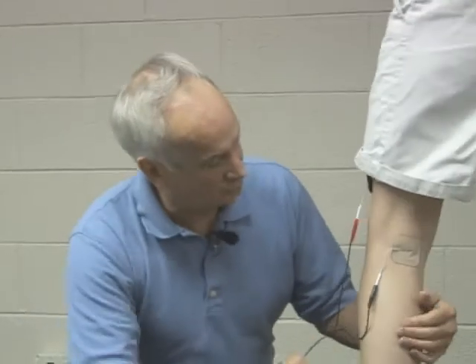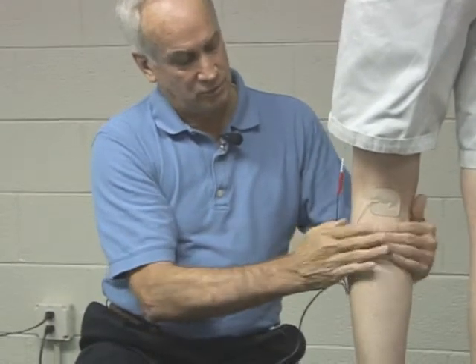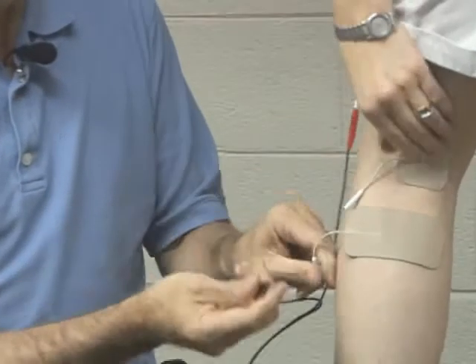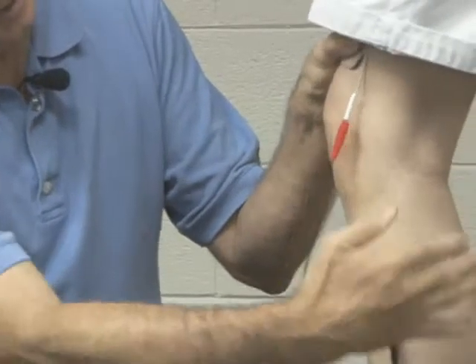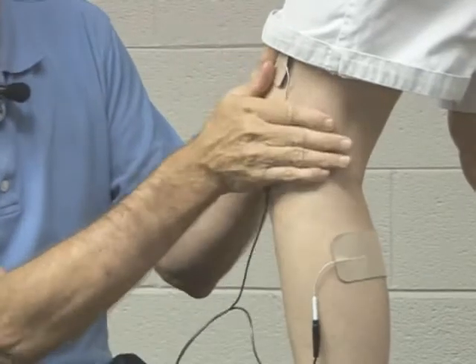For a second placement — if the popliteal area wasn't sensitive — I might put it down here where she has some muscle tissue. I'll pull this out and plug this channel in here. If she turns sideways, electricity comes out of one electrode down to the other, cutting right through her knee.